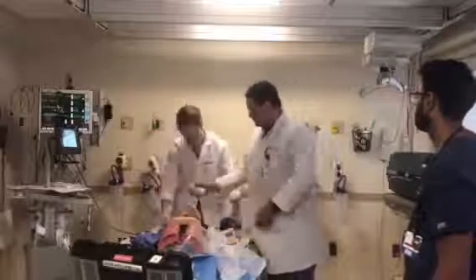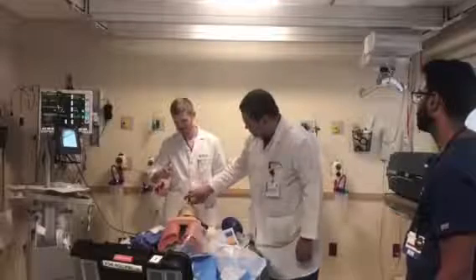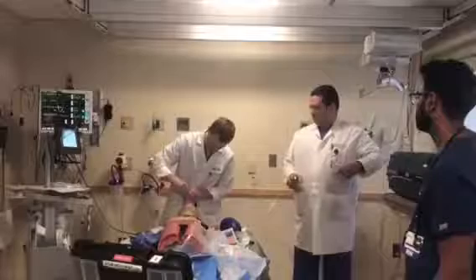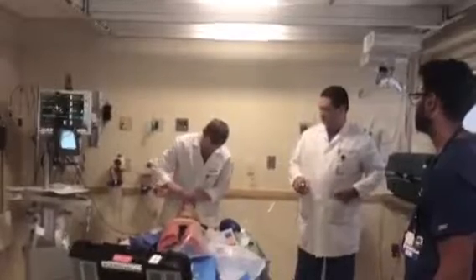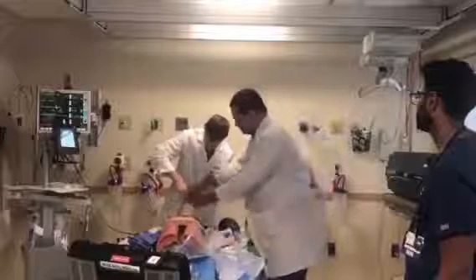So now the intubation, you got this? Yeah. The mannequin is a little bit difficult. Okay, got it.